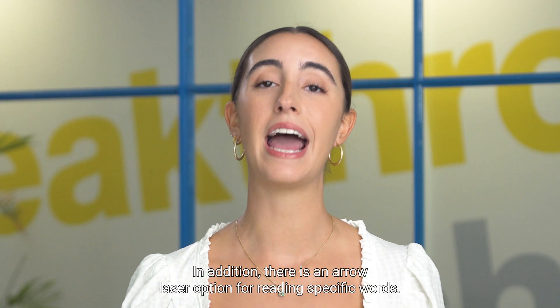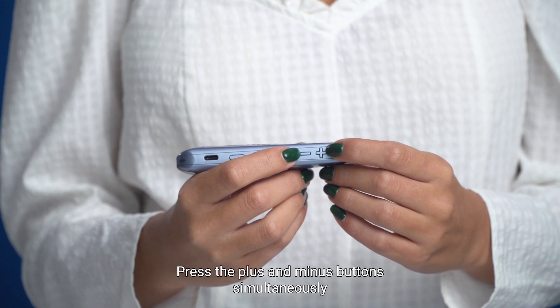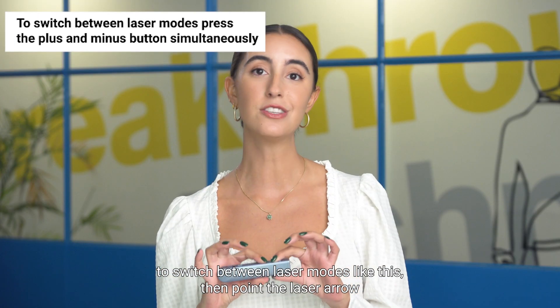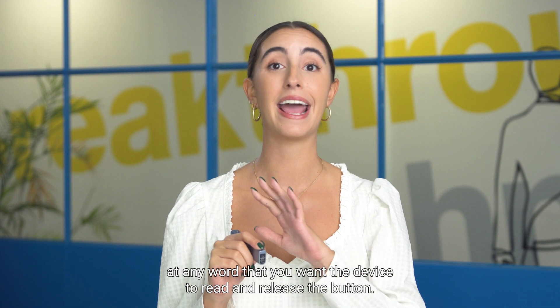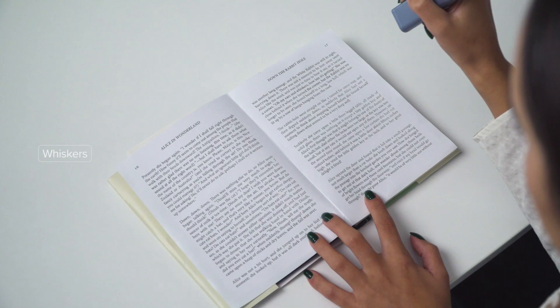In addition, there is an arrow laser option for reading specific words. Press the plus and minus buttons simultaneously to switch between laser modes. Then point the laser arrow at any word that you want the device to read and release the button.